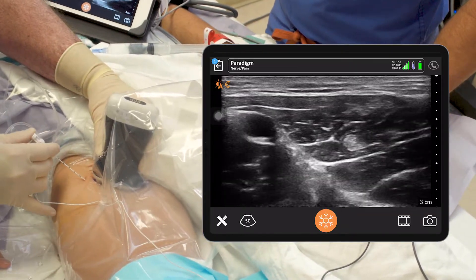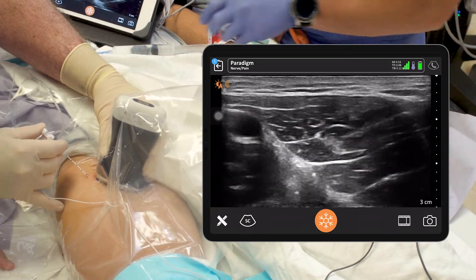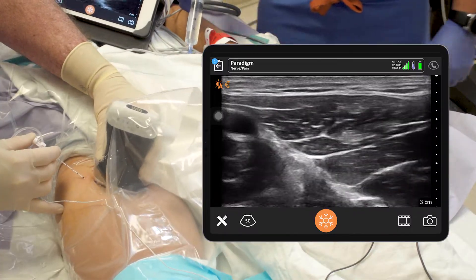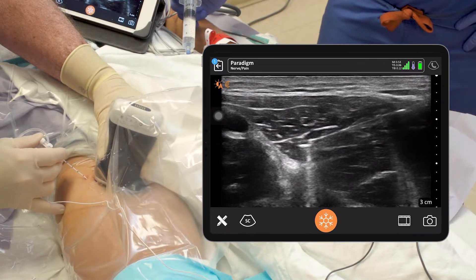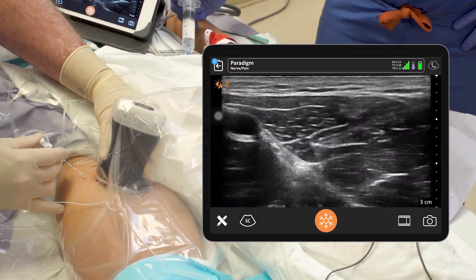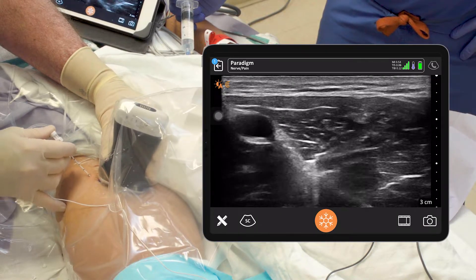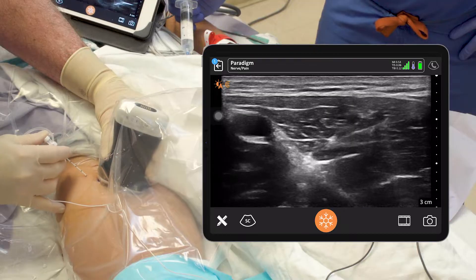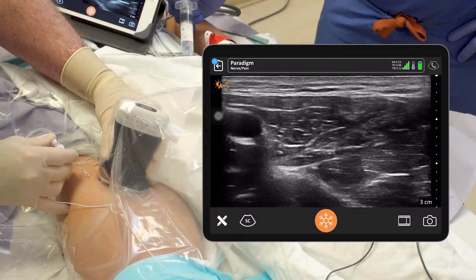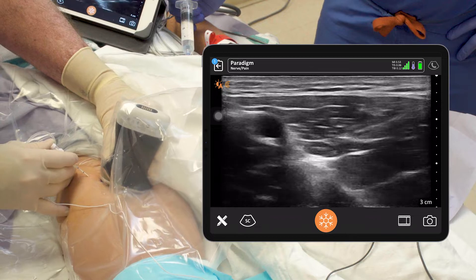A lot of pressure — you're doing good, you're doing great. Here comes our needle. As you can see with this Clarius machine, it's very small and easy to use, and you can have great visualization of the needle and the muscles that you need to see. We've got a nerve stimulator, so if we get near the nerve to the vastus it should twitch. We're not getting any twitch, so I'm going to go right on through the fascia of the sartorius.